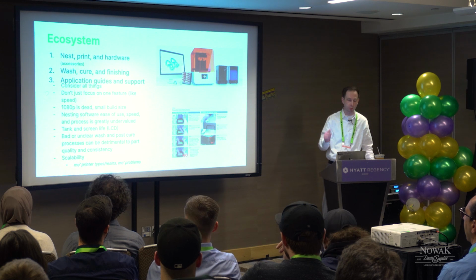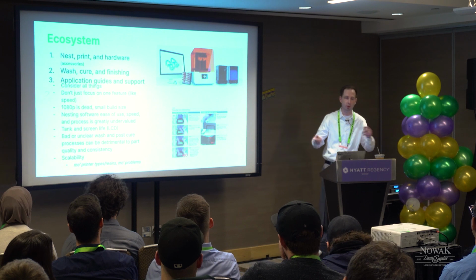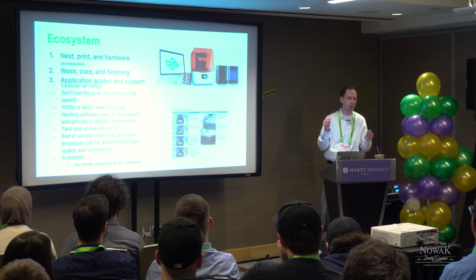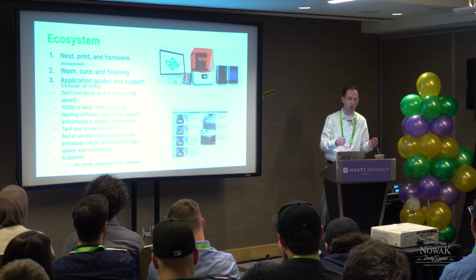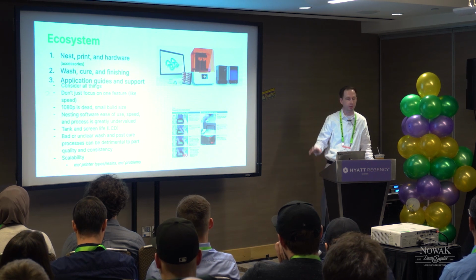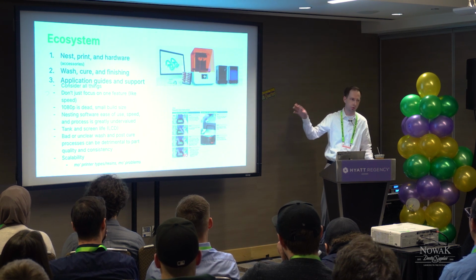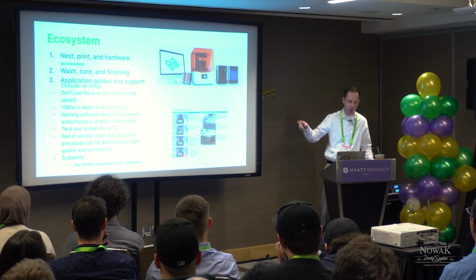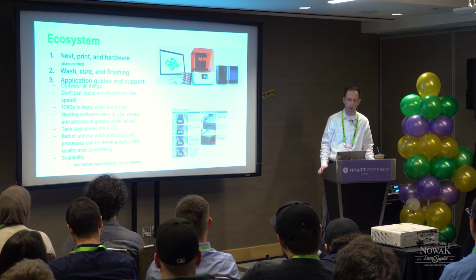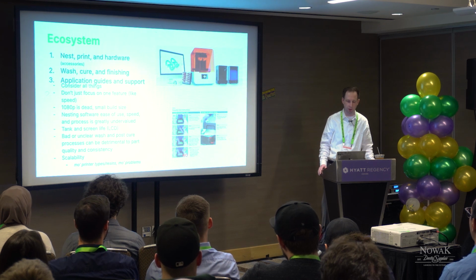Nesting software, the speed of use and the process, especially if you're doing multiple applications, say dentures, splints, models. How is it with each? Because they all have their different ways they like to be set up. Otherwise, they're not accurate, or you have Z-bleed, or you have delaminations. So if you're not bought in yet, go and look at their documentation, talk to their support teams, get their videos online, and understand it fully before investing. And if you have a system and you're just struggling with it, do the same and push to find answers if something's not working, especially in a workflow in nesting.